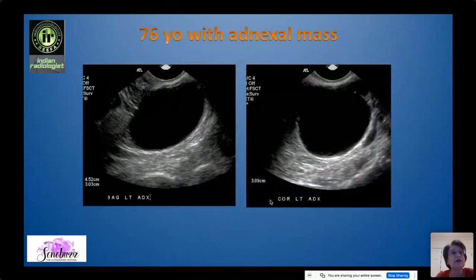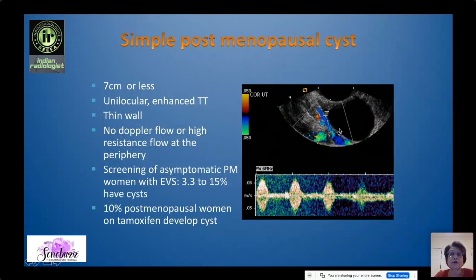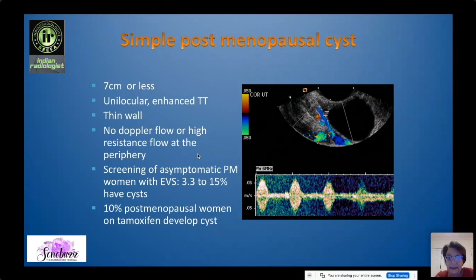In an older woman it's a little different. This 76-year-old woman has an adnexal mass of about four and a half centimeters that is completely anechoic with a thin wall — a simple cyst. Provided it is unilocular with a thin wall and no color Doppler flow or just high-resistance flow at the edge, we know that in screening of asymptomatic postmenopausal women, about 3.3% to 15% will have such cysts, and particularly 10% of postmenopausal women on tamoxifen will develop cysts. So it becomes a dilemma: when do we need to worry, and when do we need to follow them?